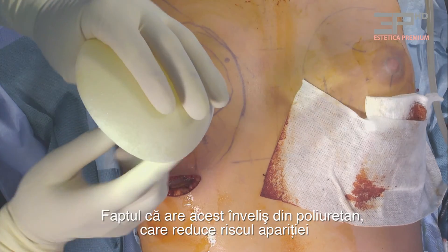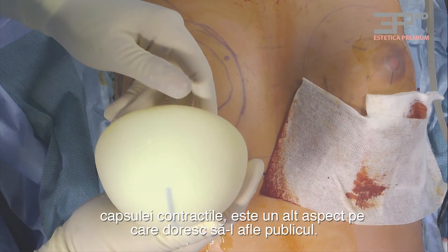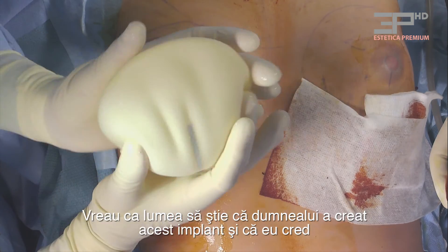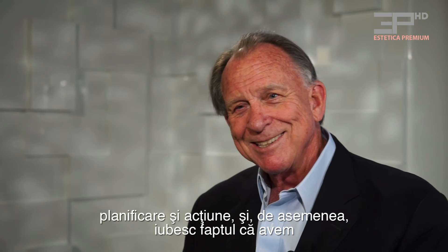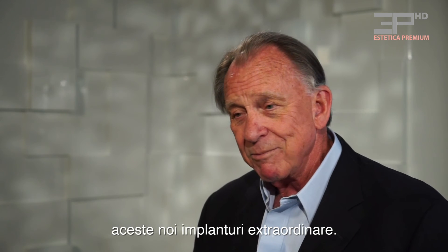The polyurethane cover minimizes fibrous capsular contracture, which is another great benefit. I want the public to know about it and that he's doing it — I think it's wonderful. It's this curiosity, fantasy, planning, execution paradigm that I love so much, and the fact that we do have an exciting new implant.